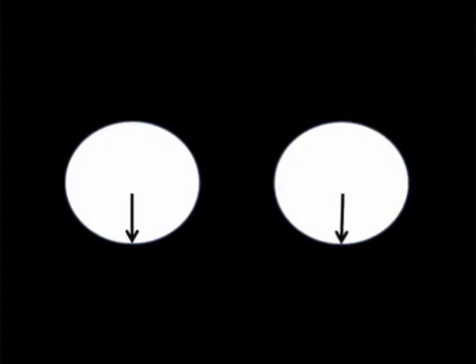So the first result of resonance is that you create a flip angle where more of the hydrogen atoms have an opposite direction to the magnetic field relative to what they were before. And the second result of resonance is that the hydrogen atoms begin to move in the same precession. They become in phase, whereas their normal relaxed state is to be out of phase.